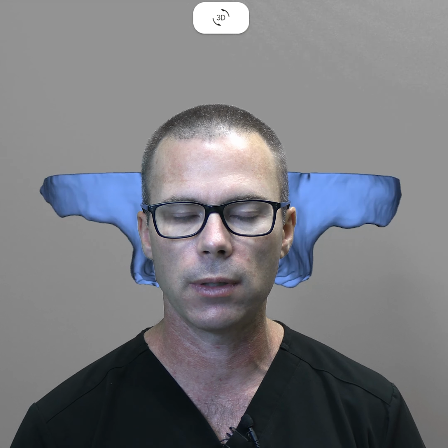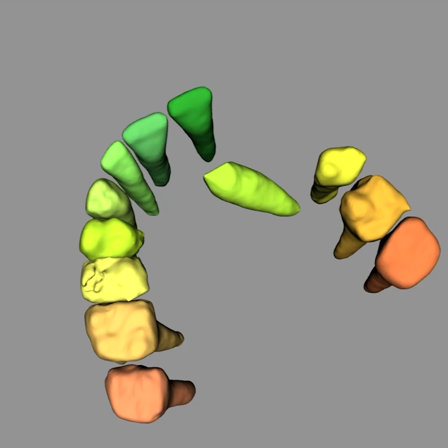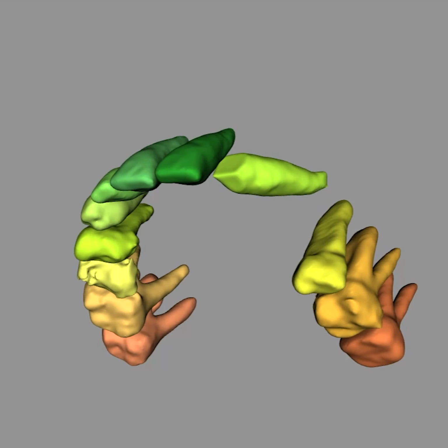Now, as this patient was older, I felt that the best course of action would be to leave the impacted canine and perform our osteotomy and implant placements in a transdental manner, especially when we place the lateral. So what I did in this case was I uploaded my CBCT into the Relu software, and I segmented out the maxilla and the corresponding maxillary teeth.